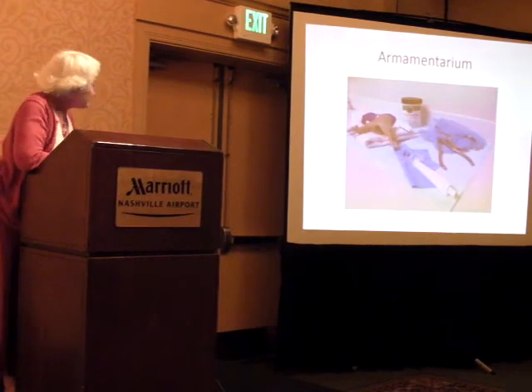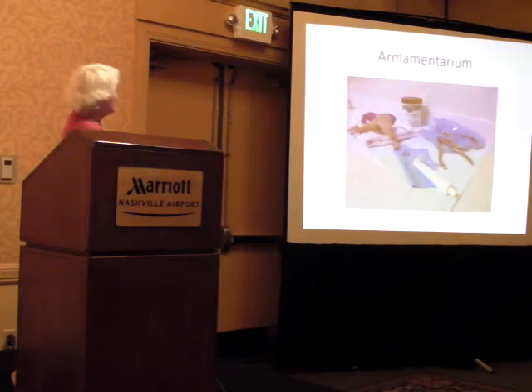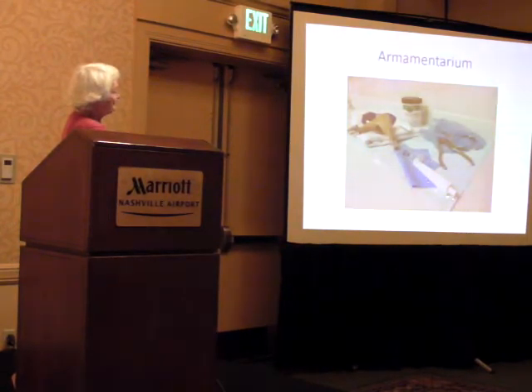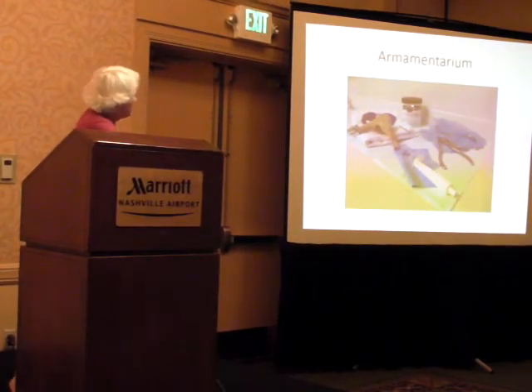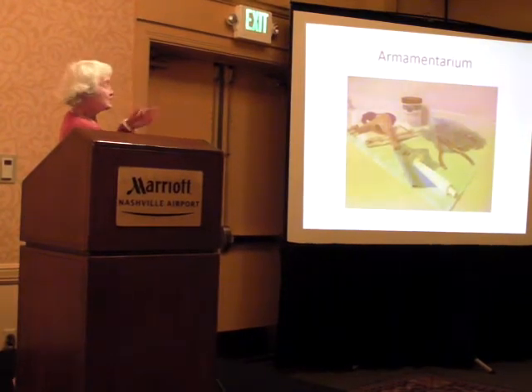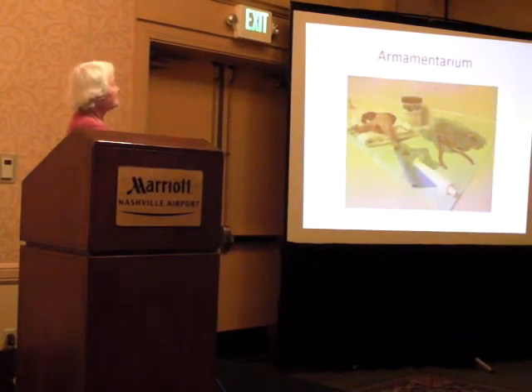Okay, the basic armamentarium that we use. We've got a bonnet available from Shine, a rubber dam clamp holder, a dental dam hole puncher. This is a clean-up put out by IABDM, a non-latex dam clamp. We use a nitrous mask. And this is the charcoal, which we just mix up in a little cup, and the patient swishes it and swallows it. We do use color therapy glasses, and then we've got a full drape.